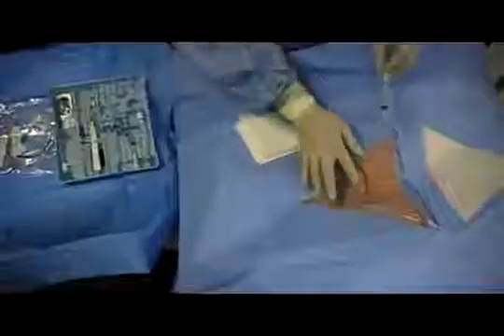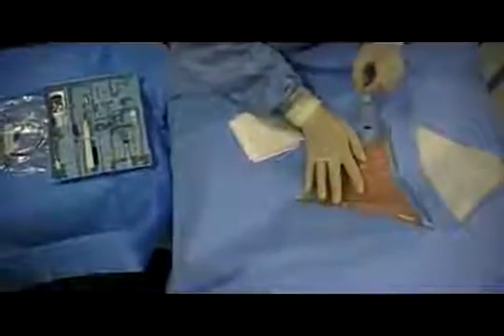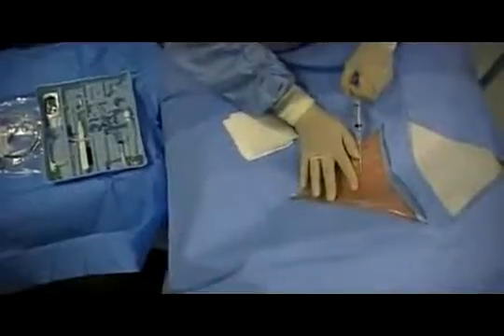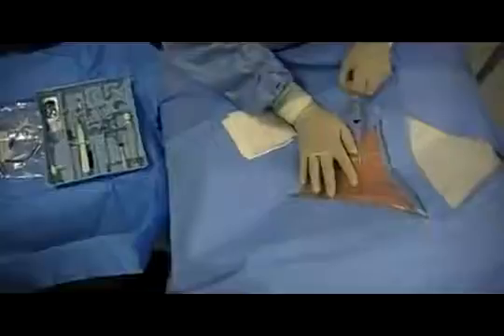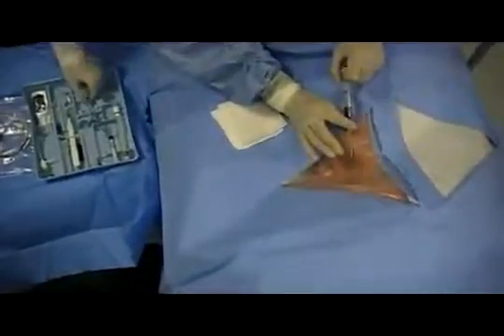This is a sterile procedure, and the appropriate anatomical site for insertion should be cleansed in the typical manner suitable for central venous cannulation. The operator dons the sterile surgical wardrobe. Sterile drapes are applied to the patient, exposing only the cleansed potential insertion site. Ultrasound guidance should be used to gain access; it is omitted here simply to provide the learner with a better view.